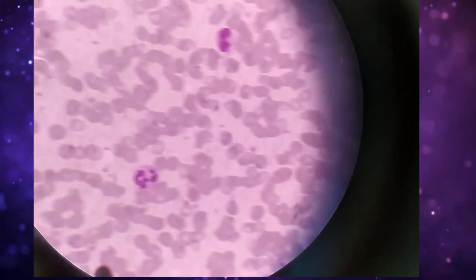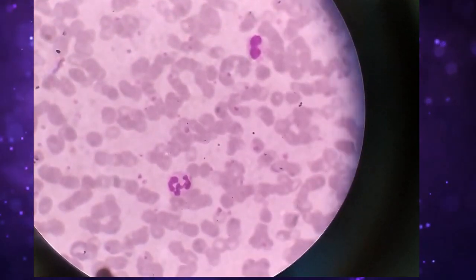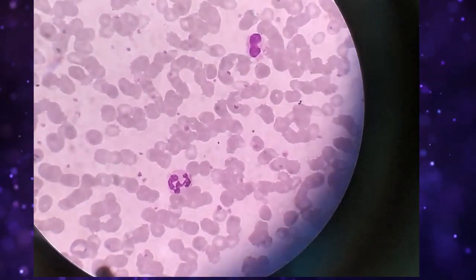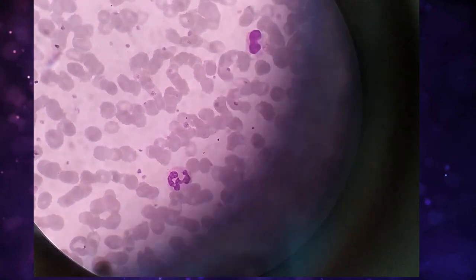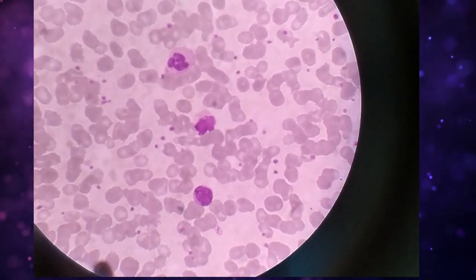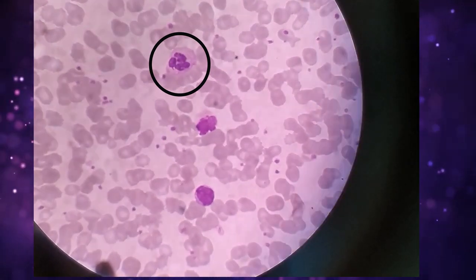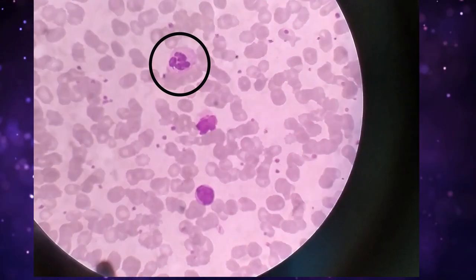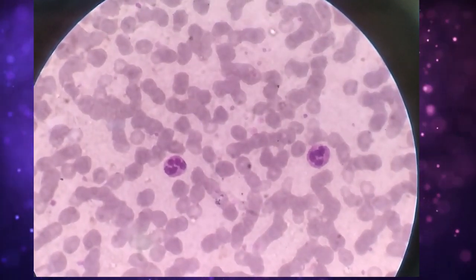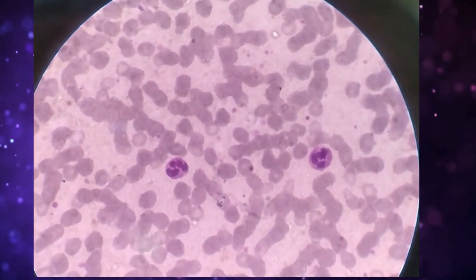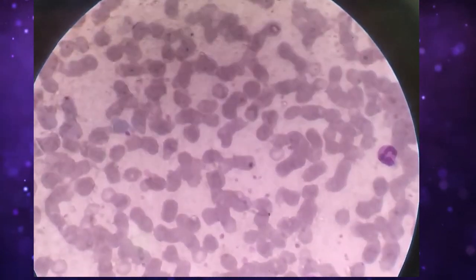Here you can see a hypersegmented neutrophil. This is under 100 power magnification. Those two cells are also neutrophils.